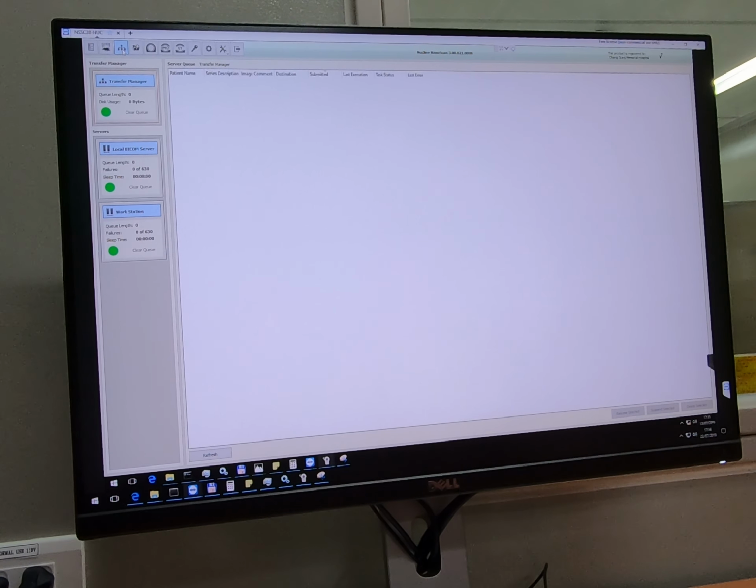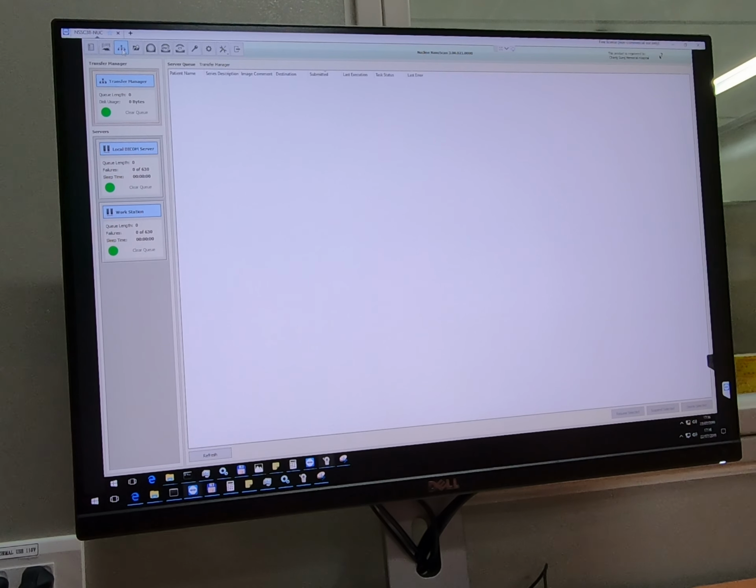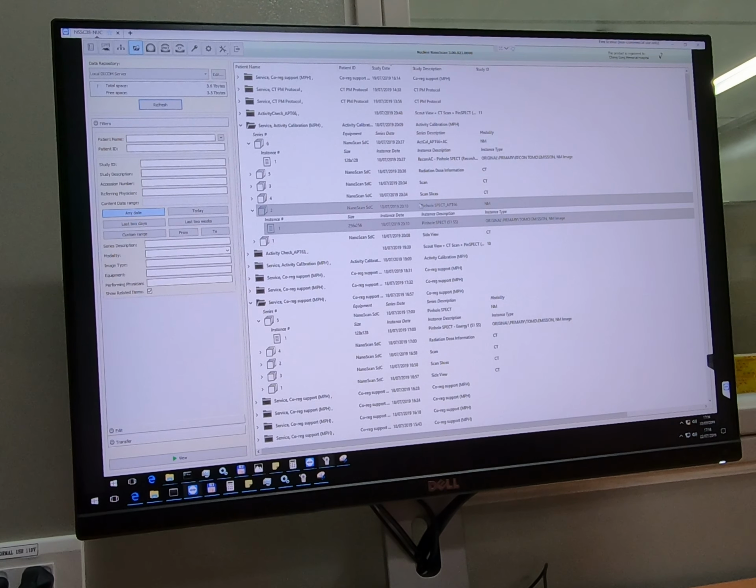It shows you whether DICOMs are transferred to be stored or not, or maybe you can also set up some target repository in order to save scans as a backup or something, so it will be also indicated here, but usually you don't need to do anything here.